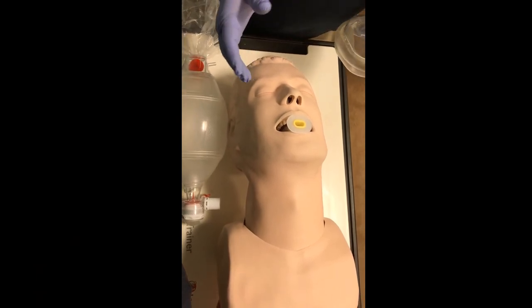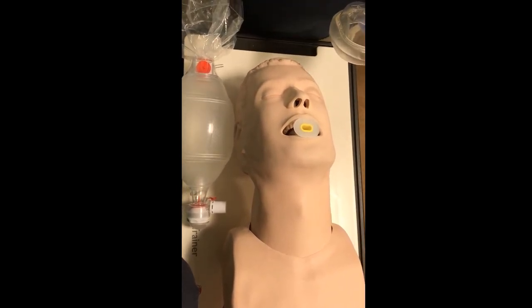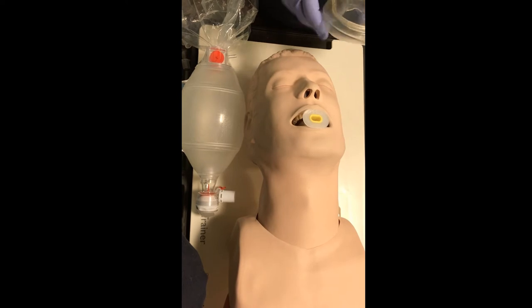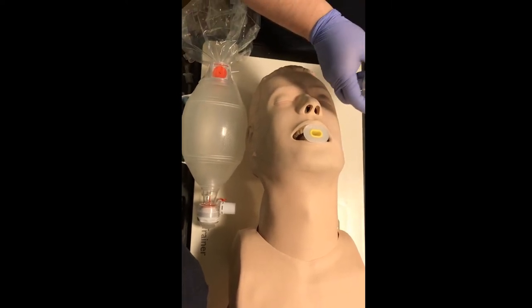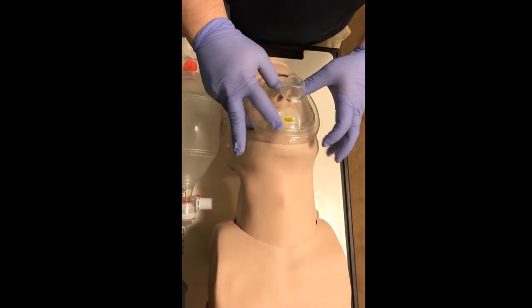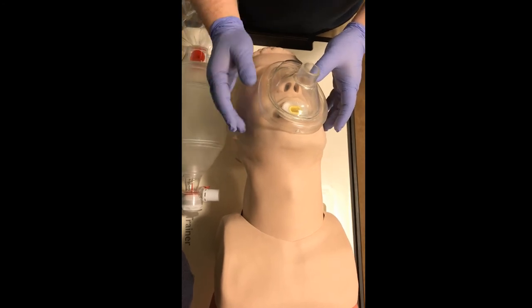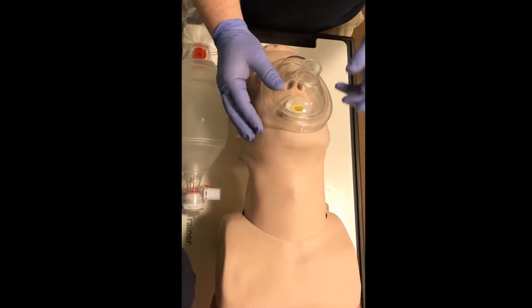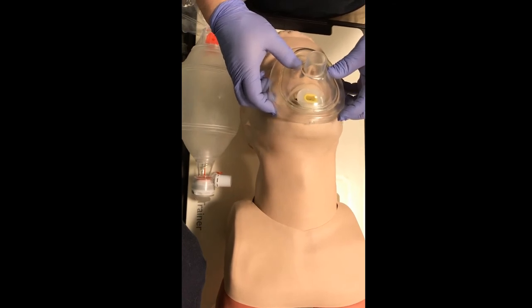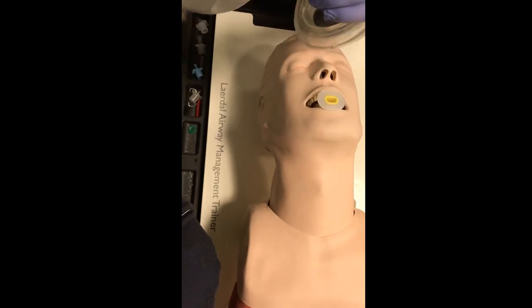We've already done our airway assessment. We've opened the airway with the head tilt chin lift, checked for patency, and determined if we needed to suction. We've secured with our OPA, and now we've determined that our patient is breathing inadequately, so we're going to assist with ventilation using the BVM for positive pressure ventilation. We take our mask, open it, and start at the bridge of the nose and walk it down into that universal 15-22 millimeter adapter.